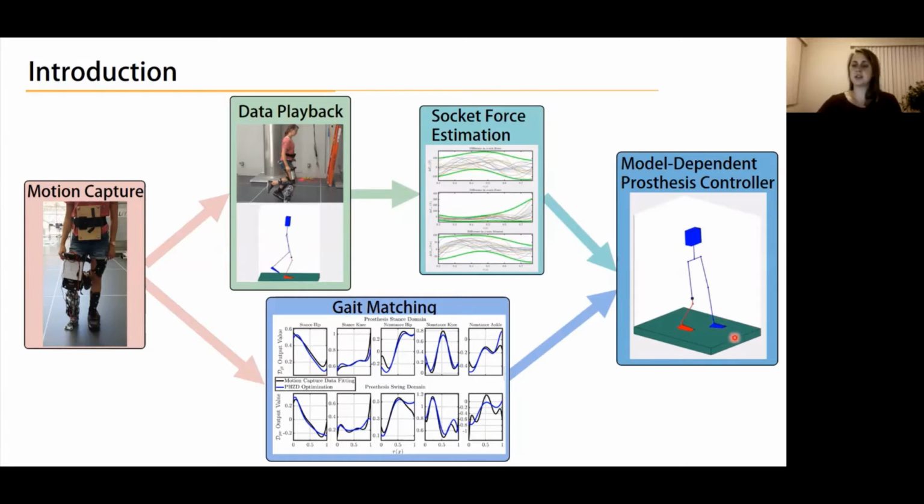So in our simulation, we have the human following these trajectories. The prosthesis is also following its original trajectories, but with a controller that guarantees stability for any force within this tube. We demonstrate these results in simulation.